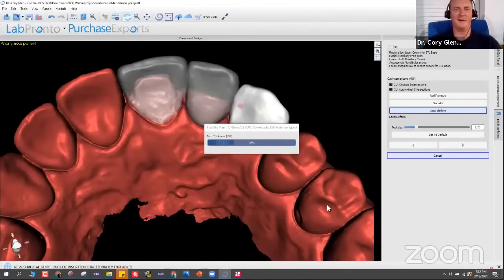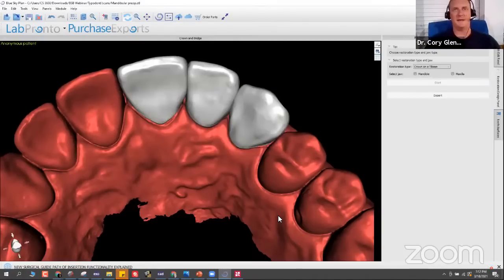Baron Grutter is the man to talk to on ortho, but long story short, the software is going to allow you to pull in their models, rotate the teeth to ideal, and then it runs it through an algorithm. You tell it how many steps you want, how many trays, weekly or bi-weekly, and it runs it through those parameters and generates those models with the teeth successively moved. And you just print those and suck them down.